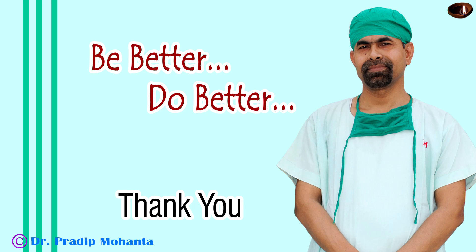Thank you very much for your attention. I hope this video will help you in developing your surgical skills, and I hope you will like this idea of using the epinucleus shell as a protective contact lens for the posterior capsule.